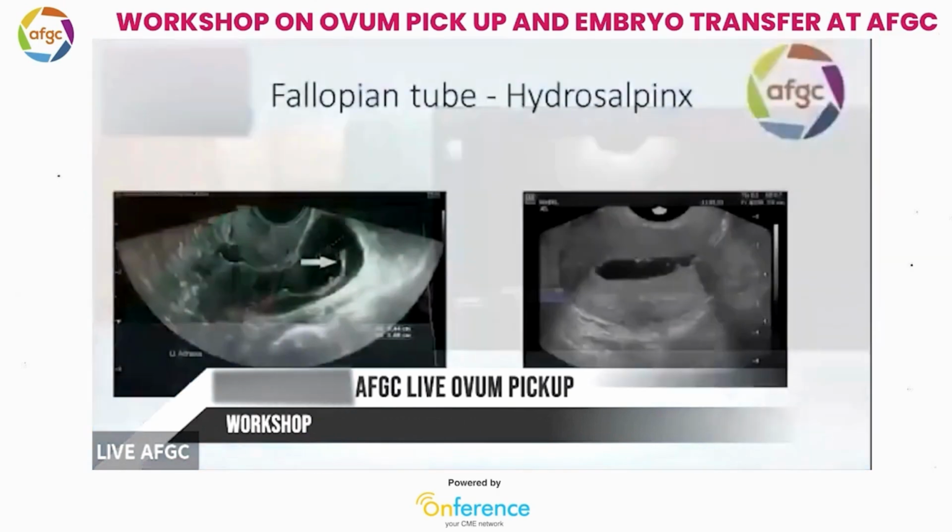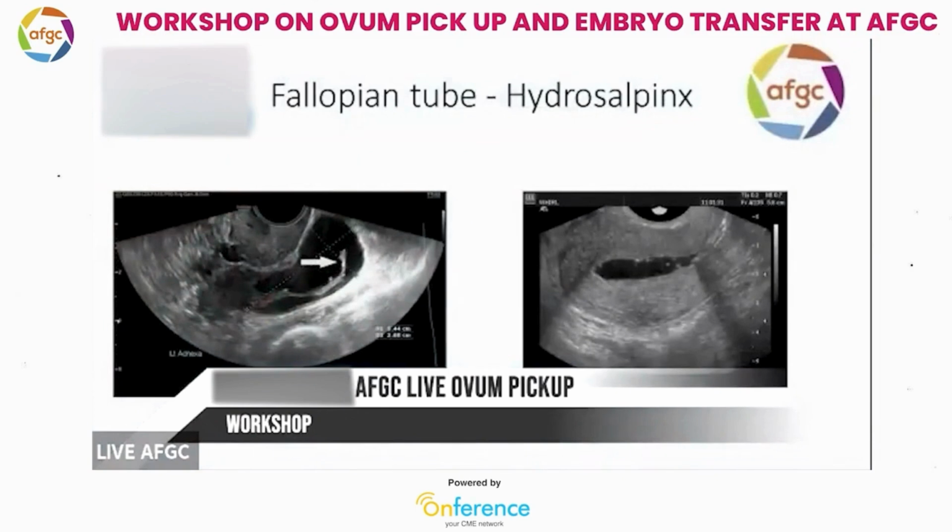PPT, and as we have seen that, can you reduce the echo? Hydrosalpinx fluid may come and go, and you have to check a patient in 2 phases.